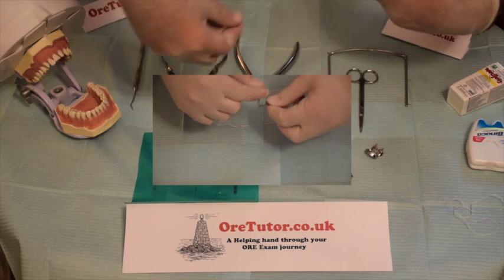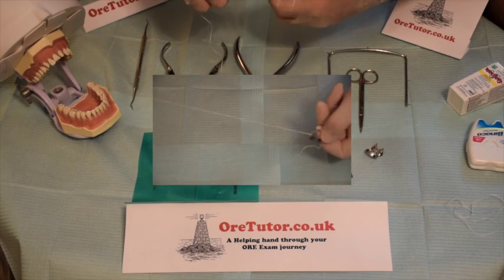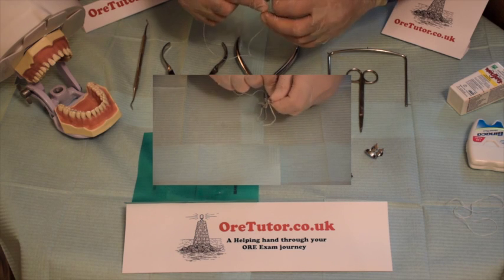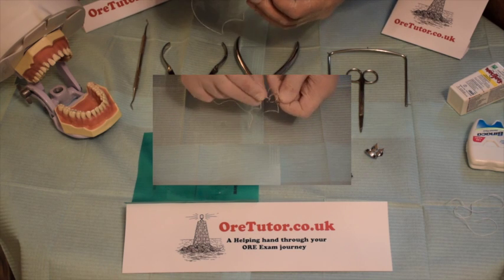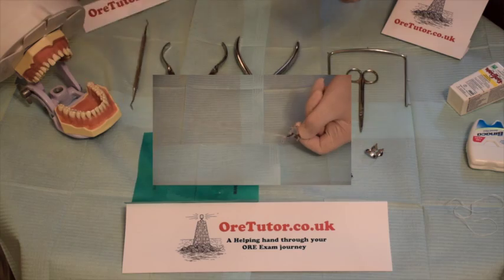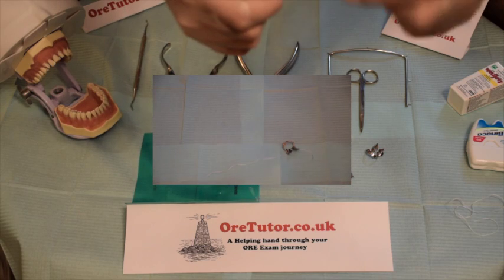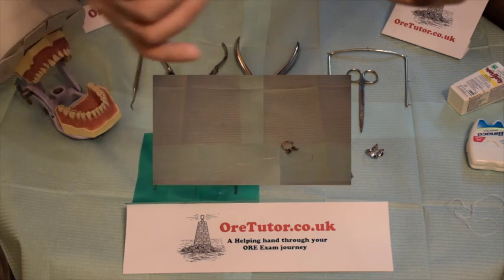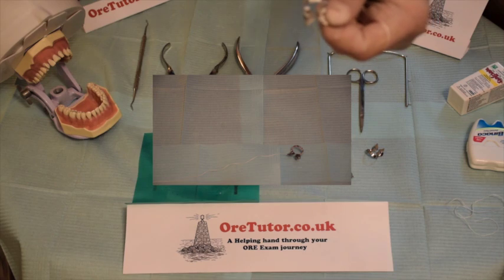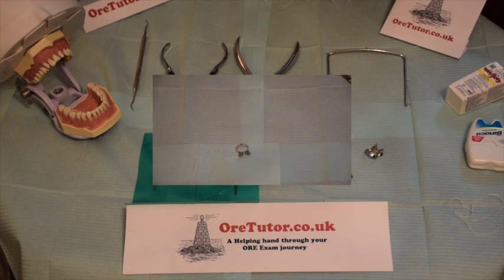Roll the floss over the rim all the way through to the buccal side of the clamp, then pass it through the hole on the buccal side. The dental floss goes from the lingual side, rolled over the rim, and through the buccal side — so when you put it in the patient's mouth, this floss will be on the buccal side. You can use scissors to cut off any extra floss from the lingual side.